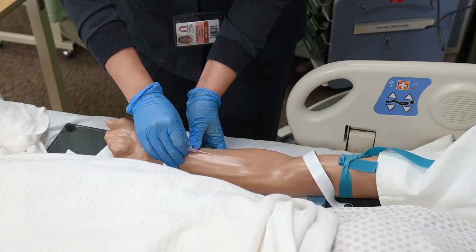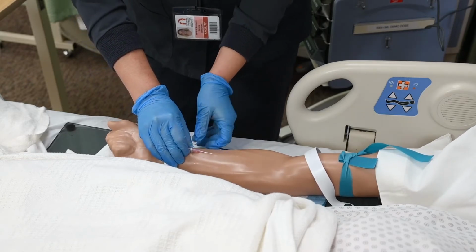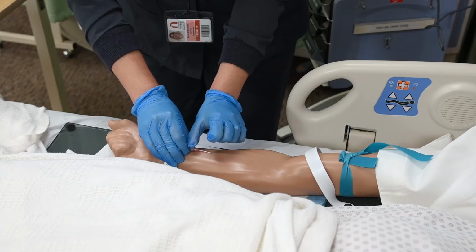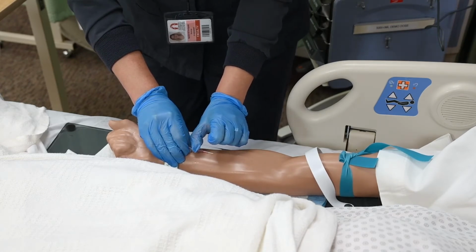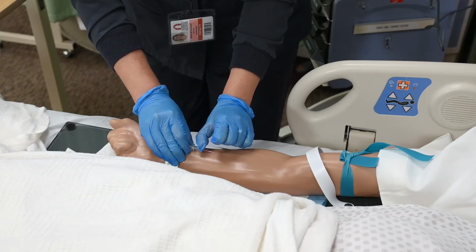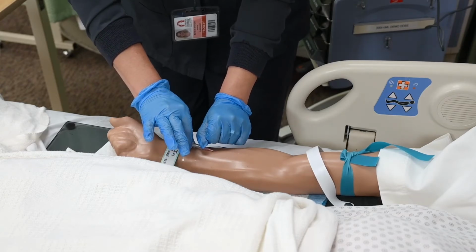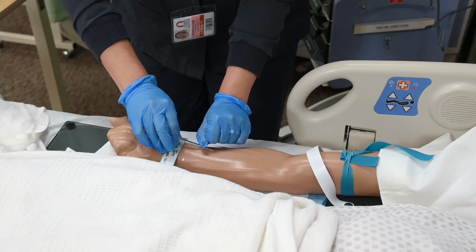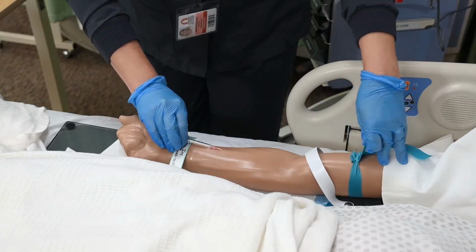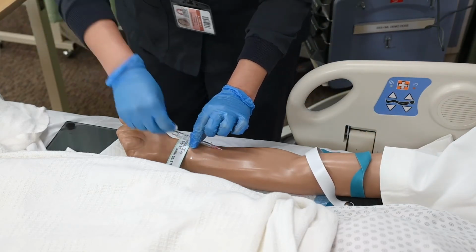Lower the needle angle and advance the catheter 1/8 to 1/4 inch into the vein. Advance the catheter off of the needle. Thread the cannula into the vein until the hub rests at the venipuncture site. Do not attempt to reinsert the stylet. Retract the stylet into the protective sheath until it clicks. Release the tourniquet. Place the 2x2 gauze under the hub of the catheter while keeping the catheter stable.